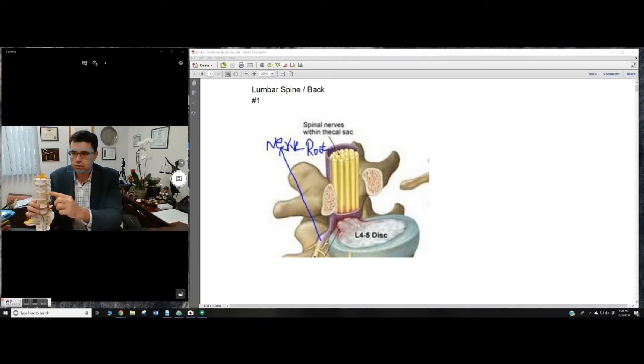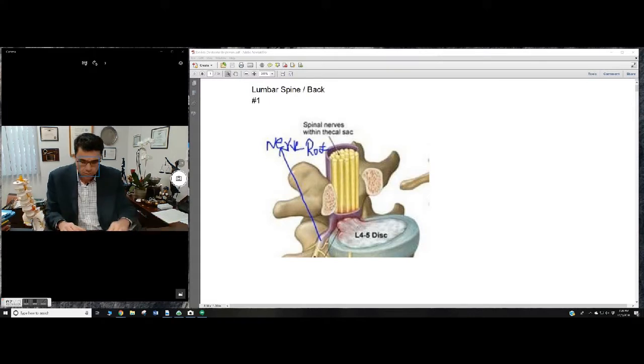where these are the nerve roots behind the spine, and then the red part is the herniation right here, where it leaks outside the disc and touches the nerve root. So then this particular MRI report also mentions that this disc herniation impresses on the thecal sac. And you can see here, this is the thecal sac where the spinal nerves are within the thecal sac.